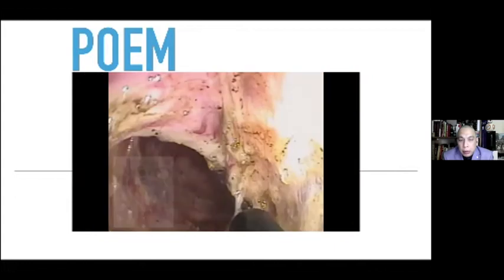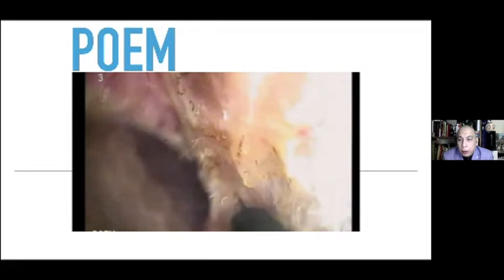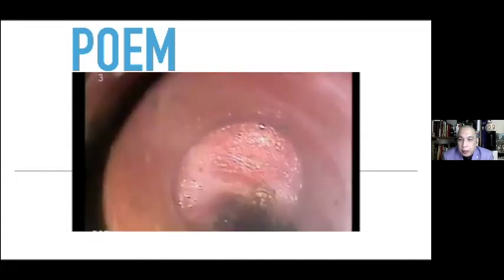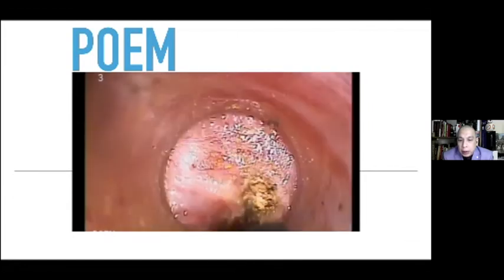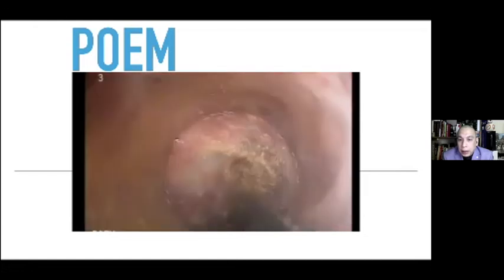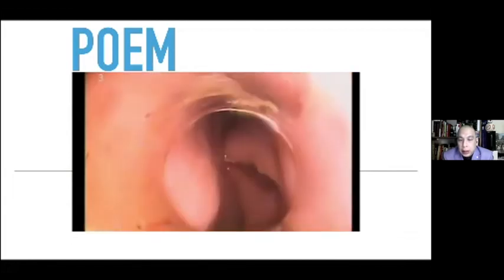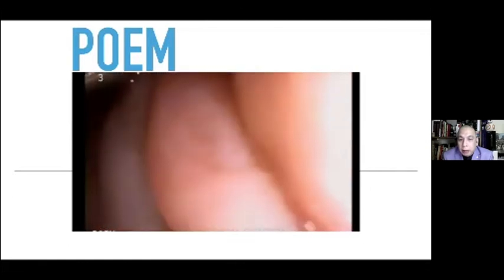Now we do specifically here, I do a full thickness myotomy. I don't have that finer skills to be able to do just the circular muscles. If you notice, it is also important that you are very familiar with settings of your ESU or your electrosurgical unit to be able to do easier dissection in some areas. Now we close the mucosal defect after the myotomy.